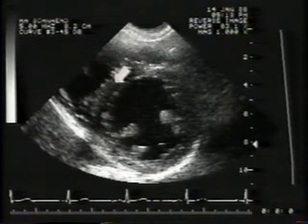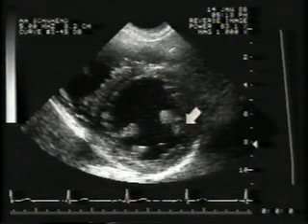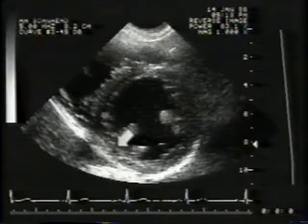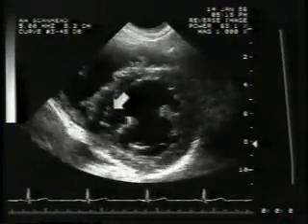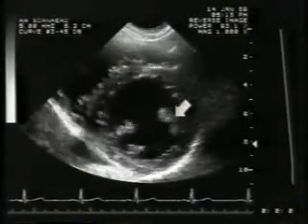In addition to the septum, the left ventricular segments include the anterior, lateral, and inferior walls. In real time, note the uniform contraction of all left ventricular segments.